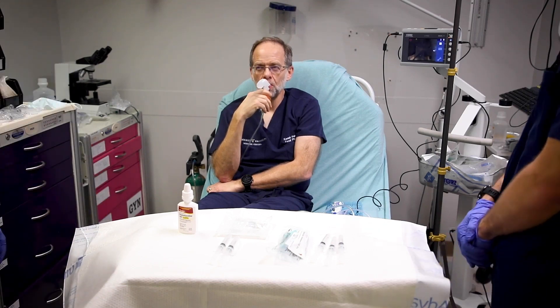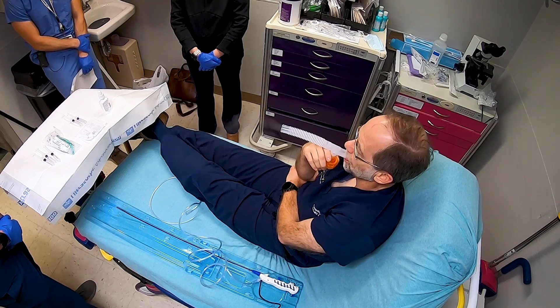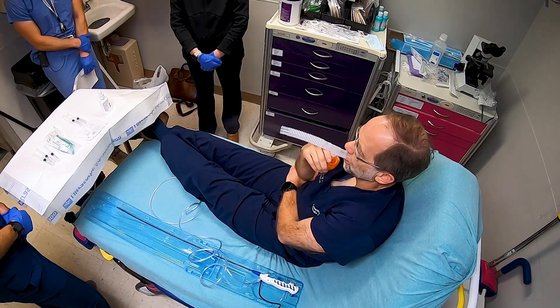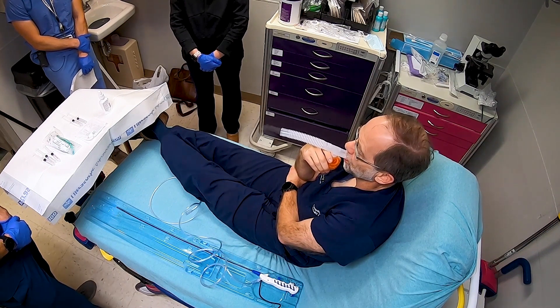The first step of this procedure is to topicalize the patient's airway. We are nebulizing 5 mLs of 4% lidocaine through a nebulizer. Remember to reduce the oxygen flow to 5 liters per minute at this step so that you have larger particle size that will topicalize the airway only and not get down into the trachea.